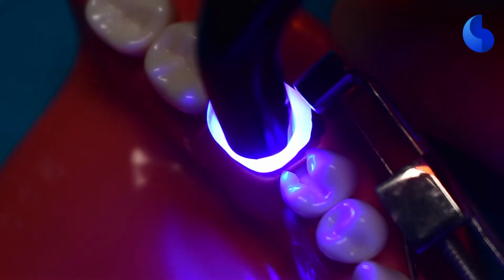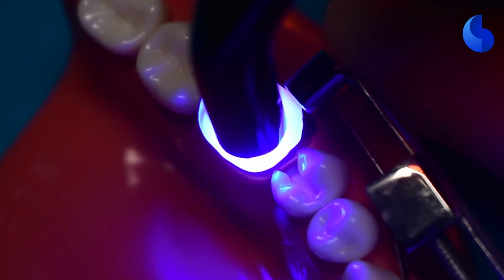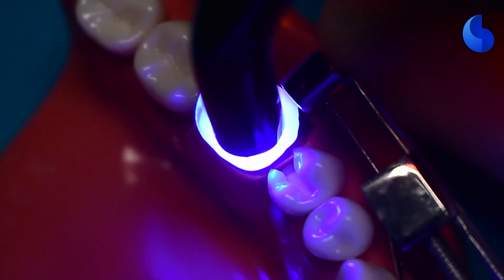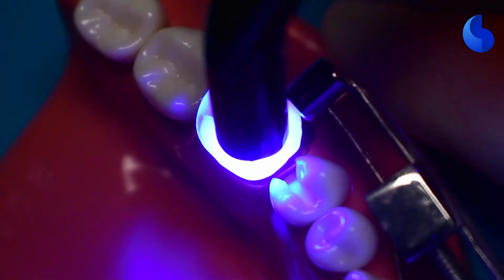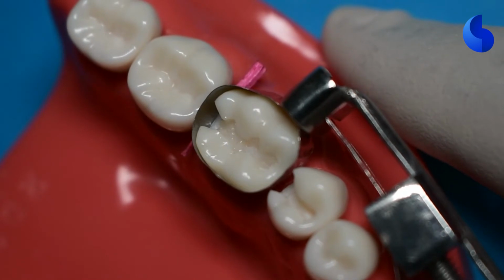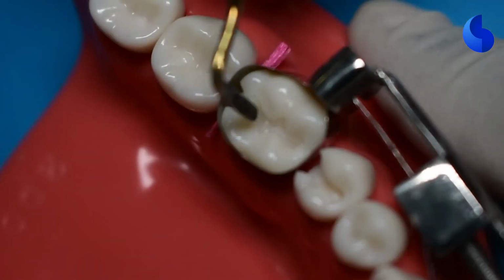However, when you're done with your restoration, do not put bonding agent on top of the finished restoration because it does two things. One is the examiner might think that you're trying to fool the examiner by closing the voids using bonding agent. You don't want to do that. And two, when you cure it at that moment, it'll look all right. But after a bit, when the examiner is trying to evaluate it, it sometimes becomes sticky, and that's not something that the examiners usually like. So once you're done with the restoration, stay away from using bonding agent.